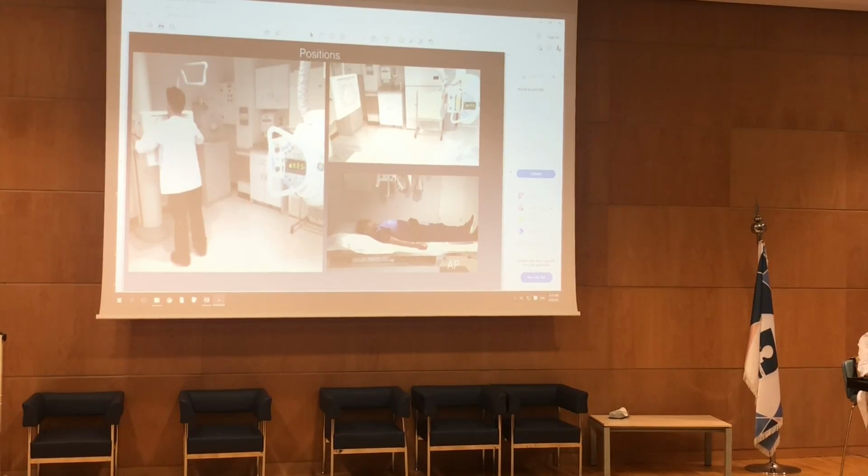So each tissue will attenuate the X-rays, and you remember, I'm sure, from before, when you studied the physics of the X-ray. Each biological tissue will attenuate the X-ray photons to a certain degree, emerging as a certain shade of gray, right? So the X-ray beam emerges from the tube, hits the patient through his back, and comes out to the detector or the screen film. Okay, so it depends if you have a digital imaging system, or you still have the analog system, where you know the screen films that we used to use before, right?